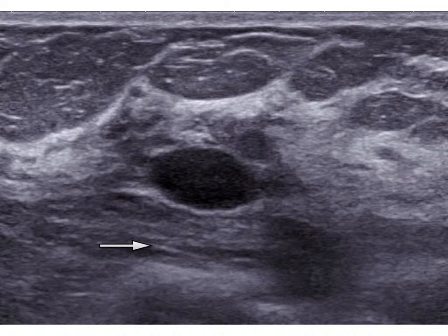So how do we identify this as a breast cancer? Look at the right side of the tumor. This is an area where the capsule extends out from the side of the lesion. This is called a tail and is a suspicious finding. The capsule is not complete. You can see how subtle this finding was.